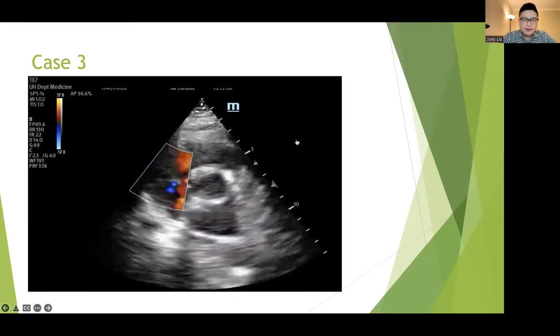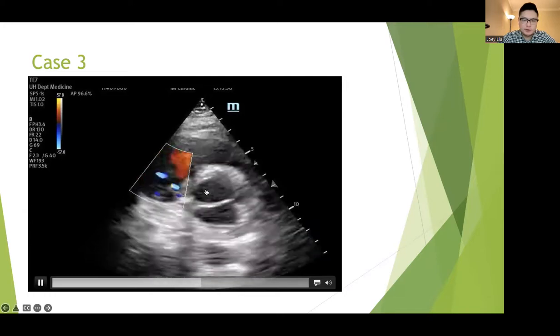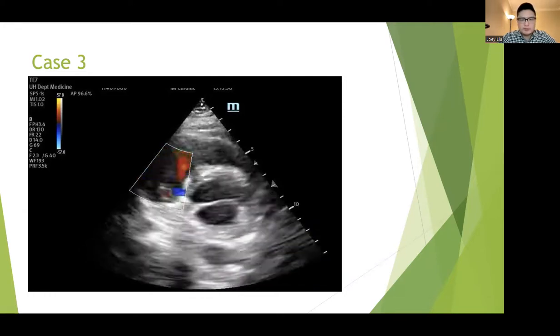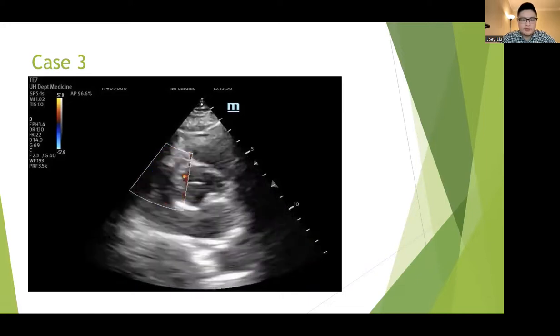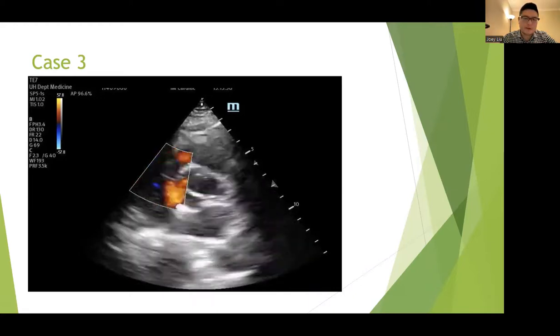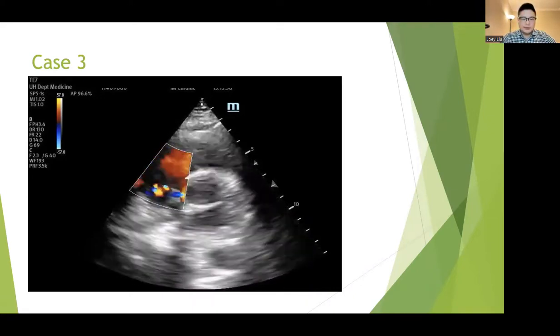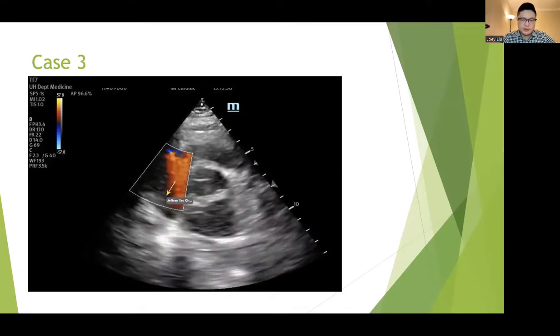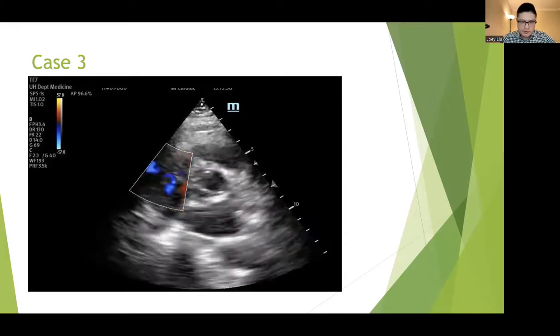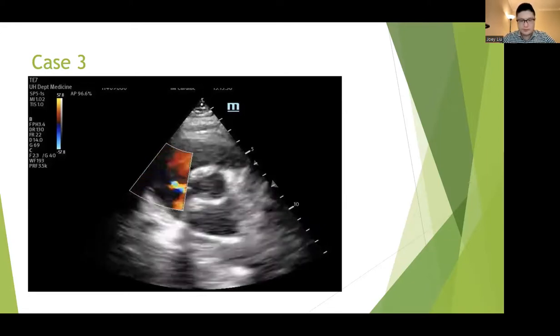And trying to get a capture of the tricuspid valve there to assess tricuspid regurgitation, a suboptimal capture, but we still felt that there were eccentric jets here that could represent tricuspid regurgitation as well. So again, to conclude so far, probably no significant aortic stenosis or regurgitation, probably presence of MR, probably presence of TR as well.